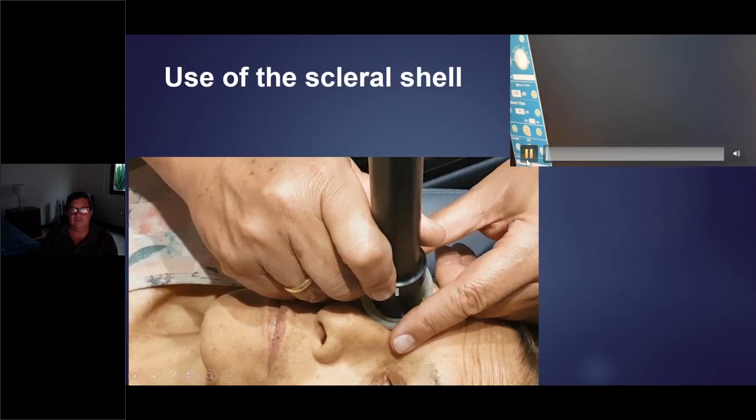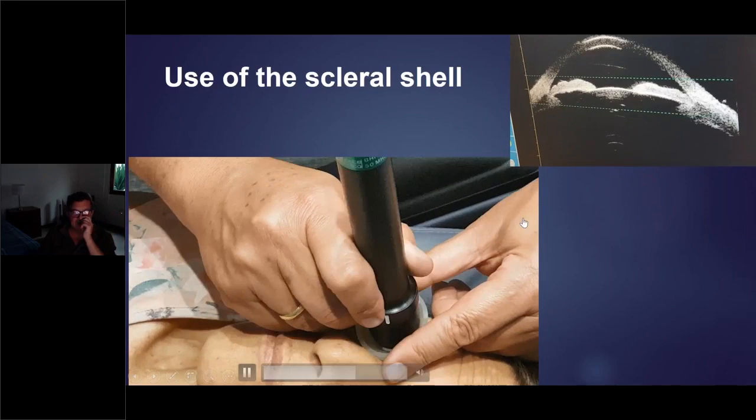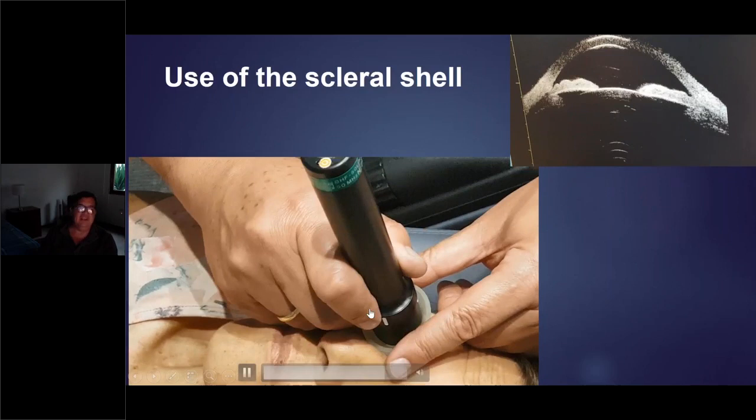Look, the green dots, the lines are the focus. You can depress or move, or you can change the perspective by moving the probe in this situation, and you can ask the patient to look down, to look up, to look nasally, to look temporal. We will see in the next slides what happens.